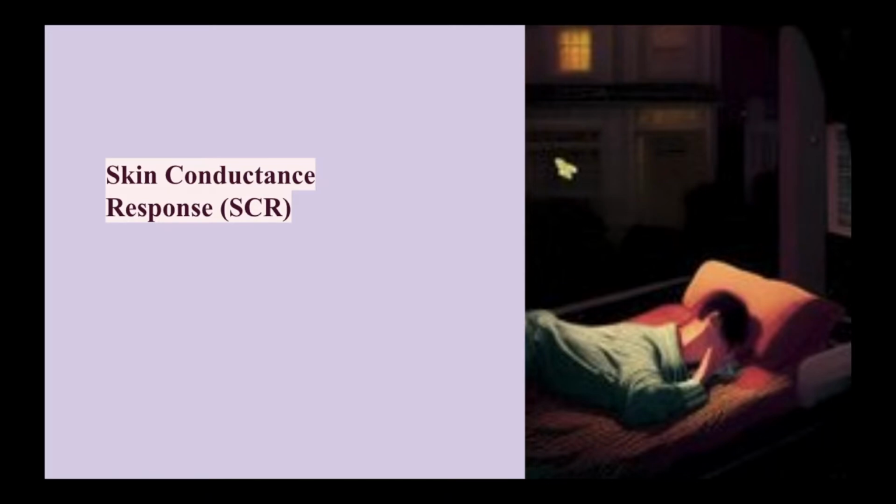There shouldn't be any other outside skin conductance response inducing stimulus. The average value also takes the SCR into consideration and is falsified with many SCR per minute. You should therefore use as quiet a frame as possible without any SCR to determine your own stress level. So they're just saying to repeat this a few times so you get your baseline average SCR.